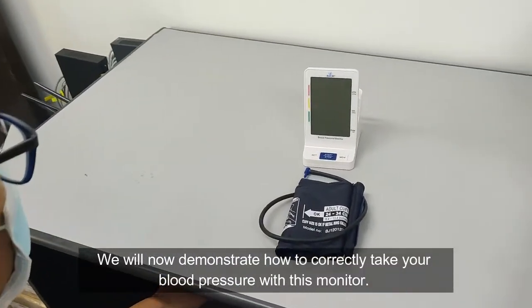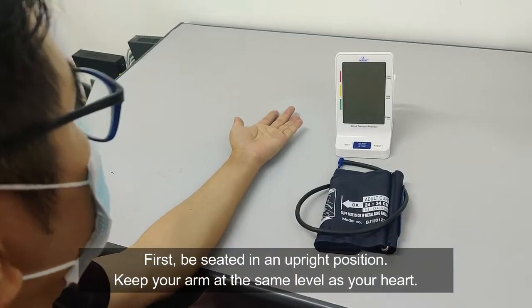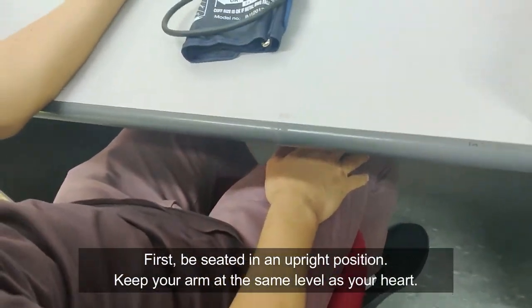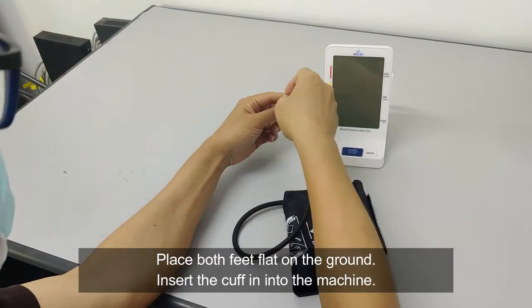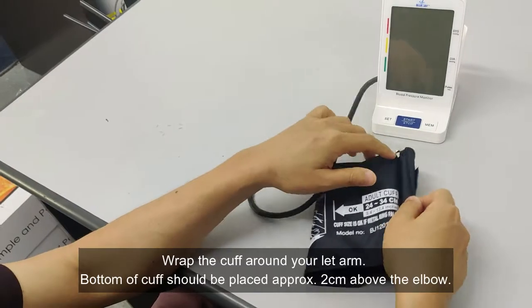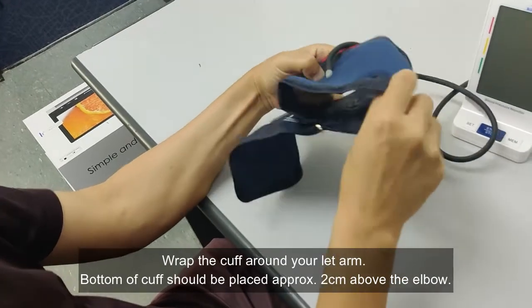We will now demonstrate how to correctly take your blood pressure with this monitor. First, be seated in an upright position. Keep your arm at the same level as your heart. Place both feet flat on the ground. Insert the cuff into the machine. Wrap the cuff around your left arm. The bottom of the cuff should be placed approximately 2 cm above the elbow.